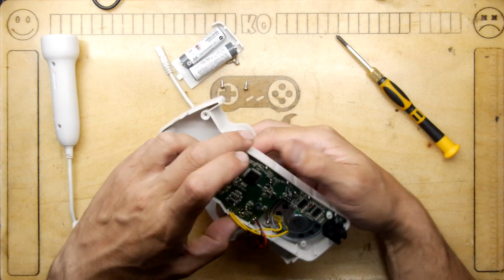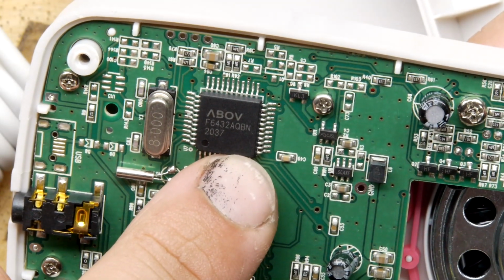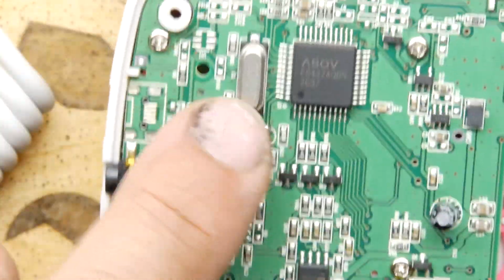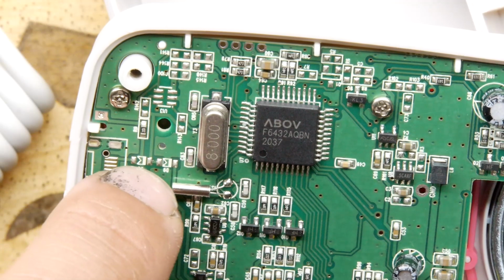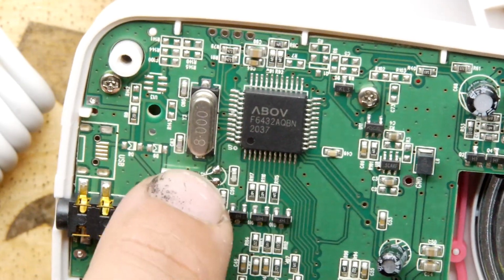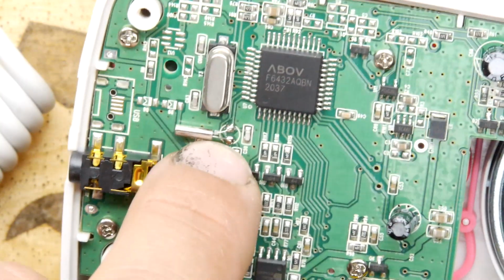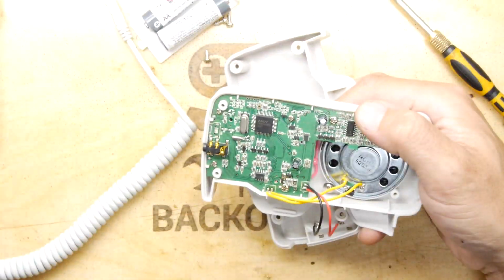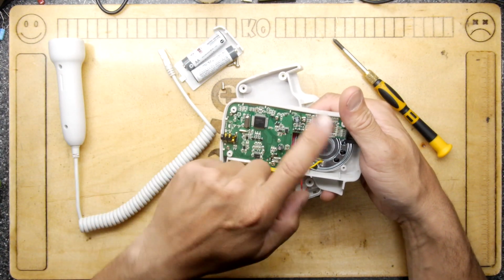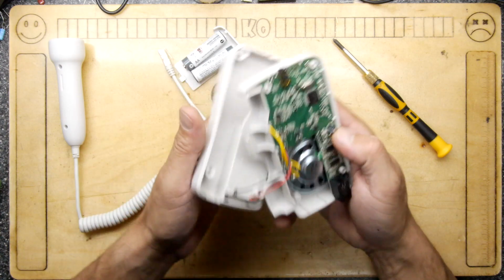And then all the work's being done by this main chip, which is running at 8 megahertz, which is a F6432 AQBN of all things. Some sort of processor, but there is next to it another little itty bitty crystal there too, so that is going into that chip, and also this big crystal. So it looks like this maybe has got two clock sources, so this is probably giving it that 3 megahertz, because if you saw on the front it said 3 megahertz. You're like, what's 3 megahertz? Well, that'll be the frequency that this will be running at, so it's probably using that as a reference for the transducer. So groovy stuff, and then just probably a bunch of conditioning and power supply junk, whatever.